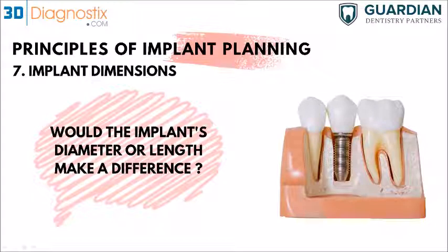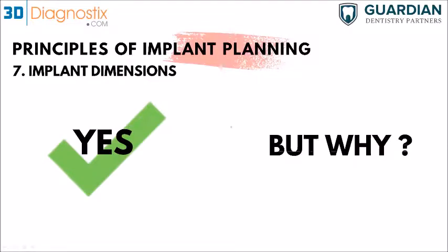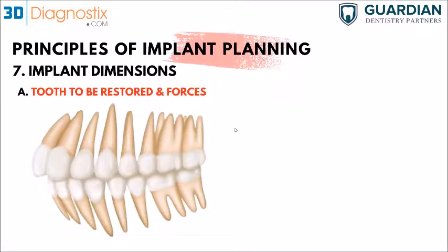Okay, so let's move on to the next point. Here, implant dimensions. Would the diameter or the length of the implant matter? Yes, it would. And how can I decide to use a wide implant or a long implant? When we talk about implant dimensions, the diameter depends on the tooth to be restored. If I'm restoring a missing molar, then I would use a wide implant because the forces falling on that molar are going to be more. So I need a bigger implant to withstand those forces.